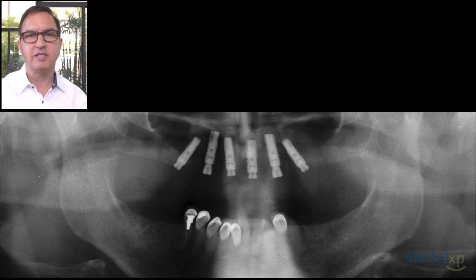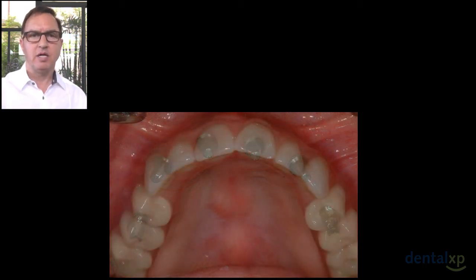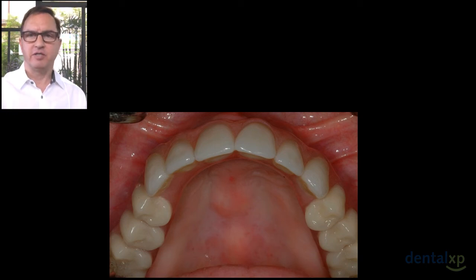and fixating the implants. So as you see in this image here, we have achieved the 30-degree angled implants in the posterior region, avoiding the maxillary sinus grafting. Here we have a well-distributed 6 implants. I have to acknowledge Charlie English for describing the AP spread. That assisted us in minimizing the amount of posterior cantilever, and eventually we went on to create a fixed, simple acrylic resin wrapped cast metal bar with complete denture teeth for this particular patient.